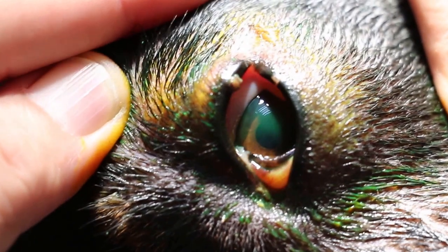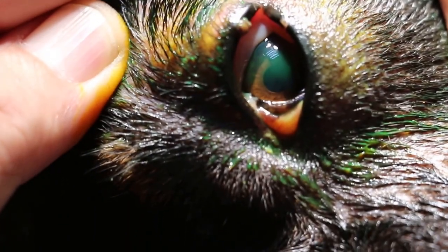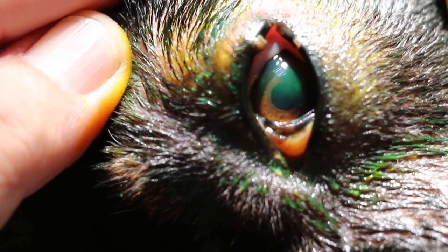Put down the lower eyelid a bit. The lower eyelid, this part, this part. You can see there's something dropped into the conjunctival area. There's a cyst there. There's a bit of a cyst there. So call the owner to come here now. Okay, you can see that.